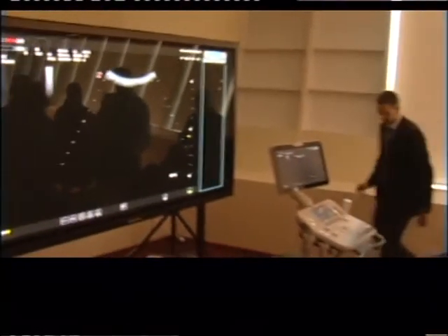Now you just go out there. And now you see bowel, lumbar plexus, quadratus lumborum, bowel. Okay? All right? So yeah, one more thing. You get that? Okay. Next person.